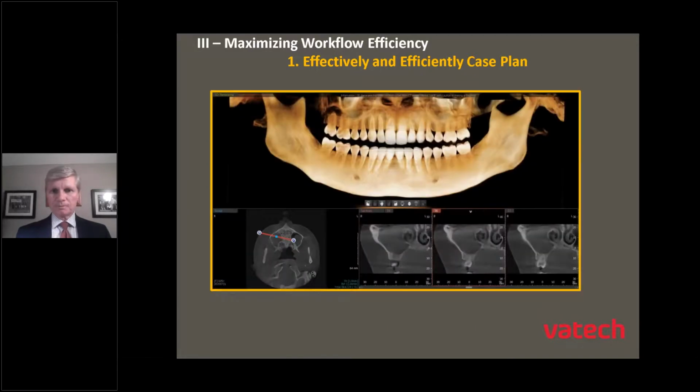Perfect example: when I'm taking a 3D scan, regardless of whether I'm going to treatment plan while the patient's sitting in the chair, or I decide, you know what, I'm backlogged today, I'm double booked, I can't treatment plan this right now, I want to take the CBCT scan, evaluate it later, and have the patient come back in and do the case presentation in our consult room, the two things I would strongly recommend doing before you ever discharge a patient from your office are this.